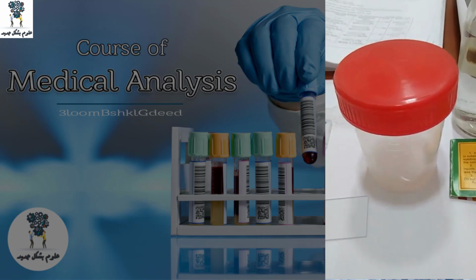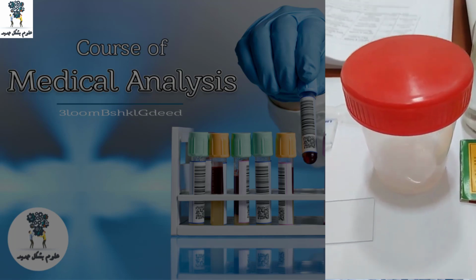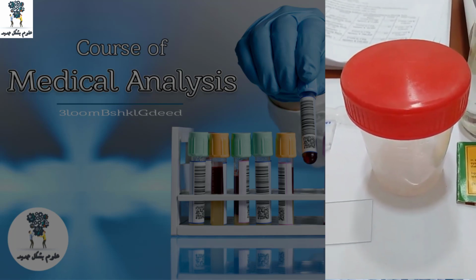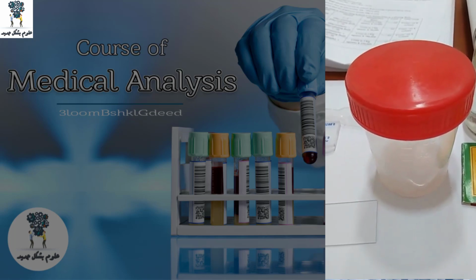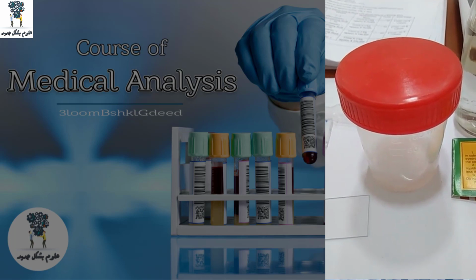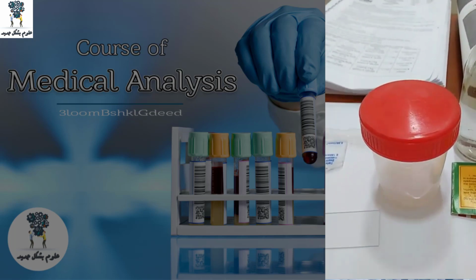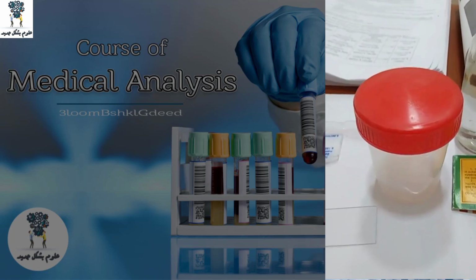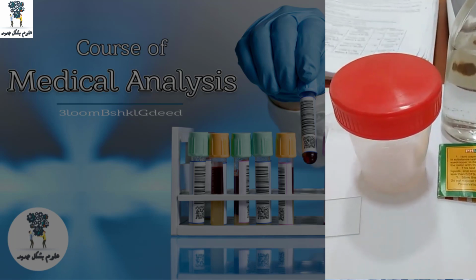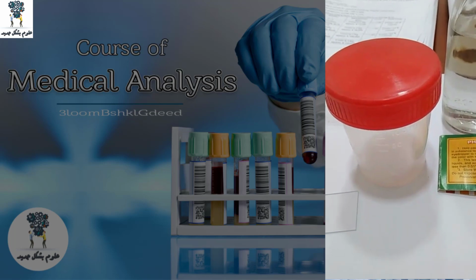Number 2, there are cases where we find no sperm, but when we check again and again, we find 1 sperm. So what will we do in this case? We will multiply by 10,000. So the final count is not 1 sperm, no, we will multiply by a factor. It's 10,000. So in this case, we will differentiate.